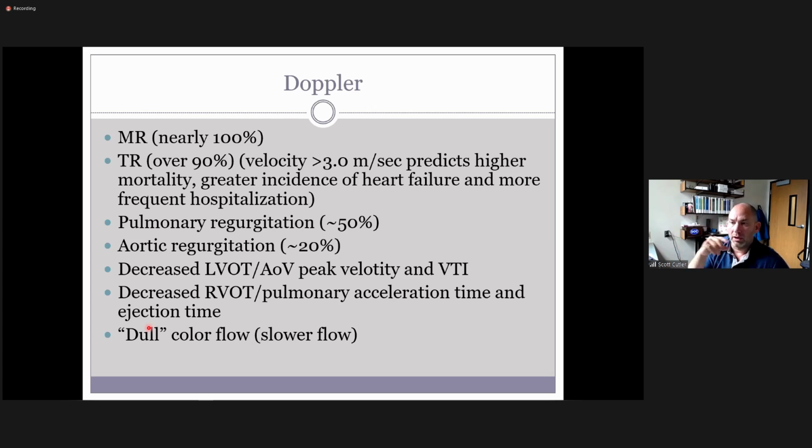And then I go and scan something else, and I need to have my color scale back down to normal, but I've got it really, really high, it may not show the normal flow state appropriately. So when you do change your color scale, just make sure that whatever you're doing to show what you're showing, you go back and change it to normal when you go to the next thing. Because otherwise it's going to hide or amplify what's going on. And that is dilated cardiomyopathy.